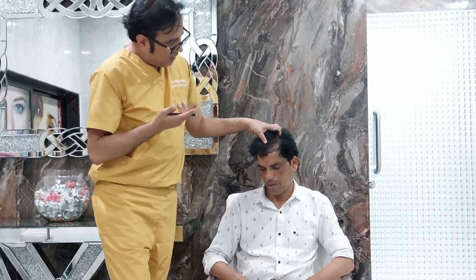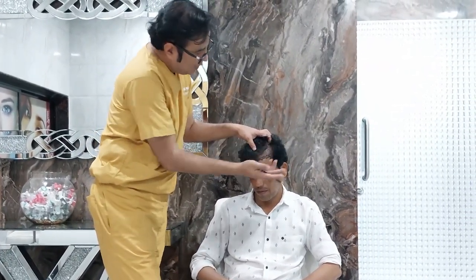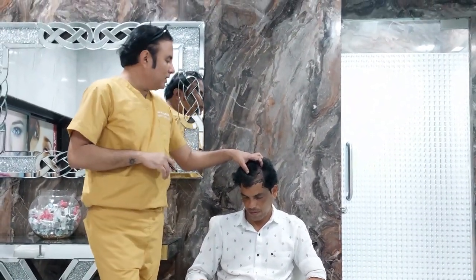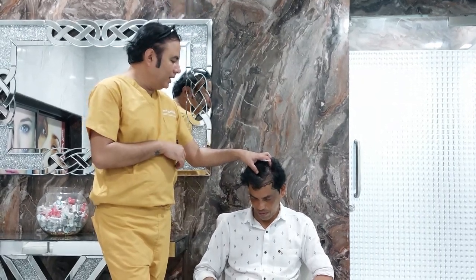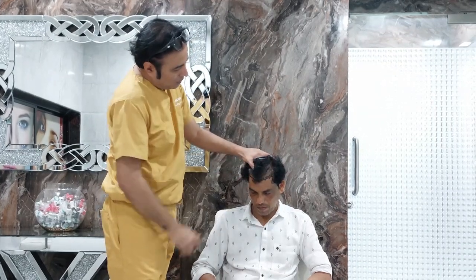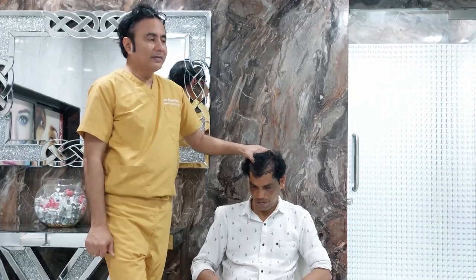Obviously, we also have to explain to the patient that if there is graying of hair, it's going to be the gray hair which will be transplanted. So once we have marked the hairline, we will go ahead and do the trimming now. And once we have done the trimming, we will be marking the donor area, and we will be doing the FUE technique. Alright, that's how we design the hairline.